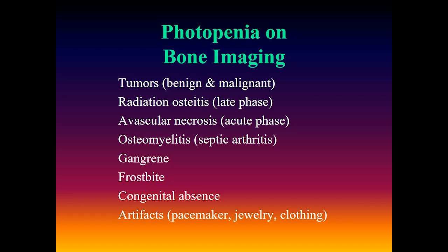Other conditions that will result in photopenia on bone scans include gangrene, frostbite, congenital absence of a bone, and artifacts such as pacemakers, jewelry, and clothing.